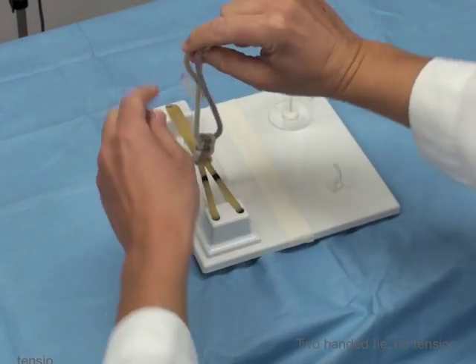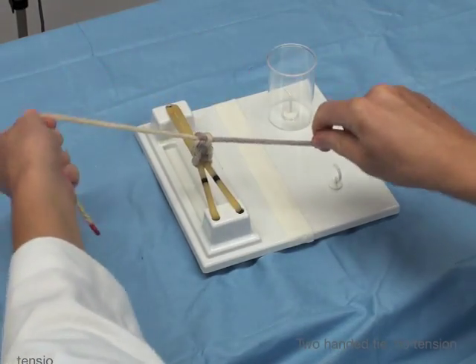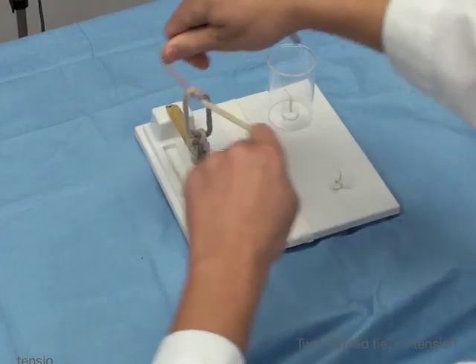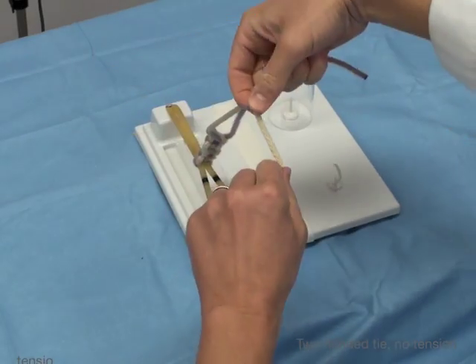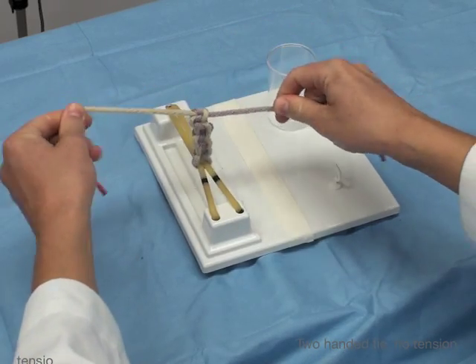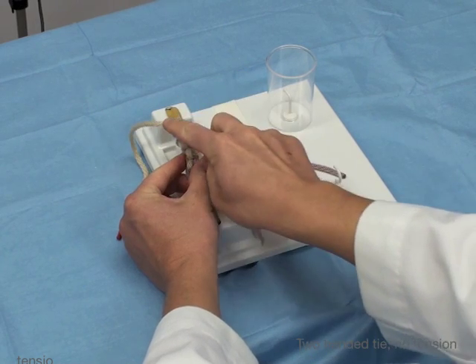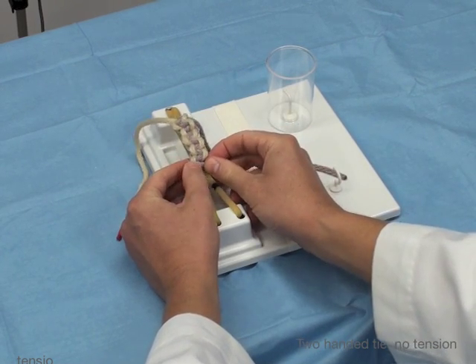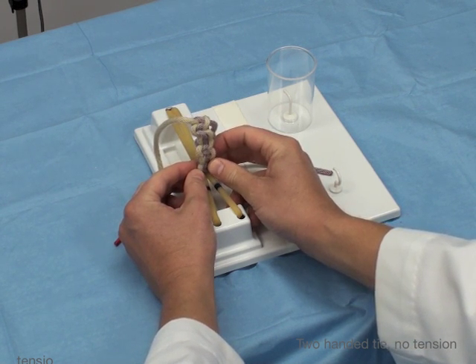Now I'm going to do several of these. As you can see I'm creating nice flat square knots and they're lining up with the colored strands. They're all lining up in a nice flat square manner. You can see the white strands are all lined, the purple strands are all lined. These are flat square knots, and that's how you do a two-handed tie.